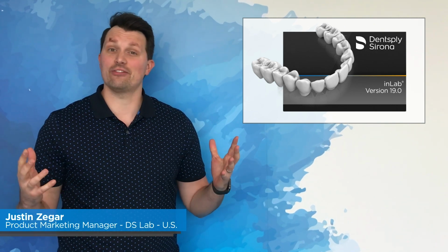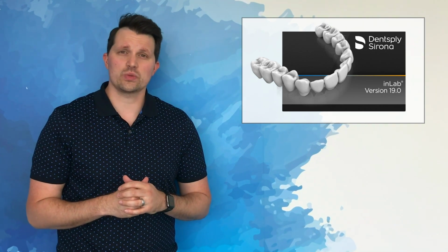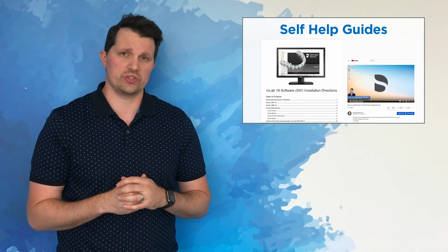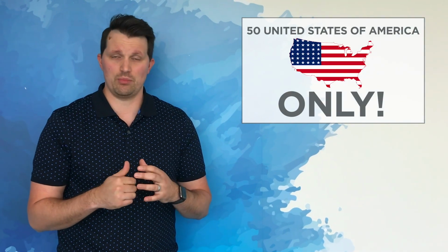We are excited to have all of you here today to share with you what's new with the inLab Software 19, as well as the new rollout process and some of the self-help guides that we have for you to install the software. What we're going to do today first is discuss the new process before we go into the new features with Jay Black.